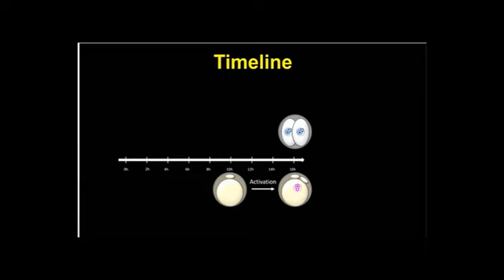Meanwhile, also at hour 16, the cleavage of the male haploid embryo will be confirmed. Those cleaved embryos carrying duplicated copies of the male genome will be selected for reconstruction. Then a single male haploid androgenote will be isolated and transferred into the perivitelline space of the recipient oocyte. Followed by fusion, the reconstructed biparental zygote will be monitored and cultured.